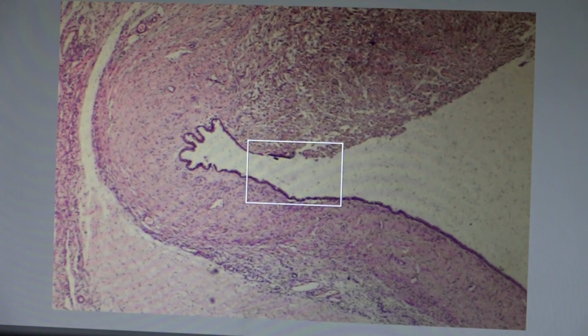Most of the common lesions of the ovary are the cyst, ovarian cyst. Ovarian cysts are classified into either non-neoplastic or neoplastic. The non-neoplastic are functional follicular cyst, corpus luteum cyst, luteinized cyst, while the neoplastic cysts are either mucinous or serous cystadenoma, or serous tumor or mucinous tumors. And this is the mucinous cystadenoma of the ovary, benign mucinous tumor.